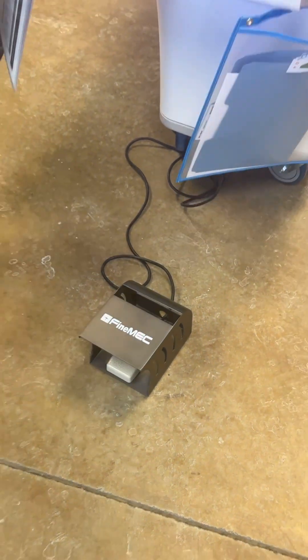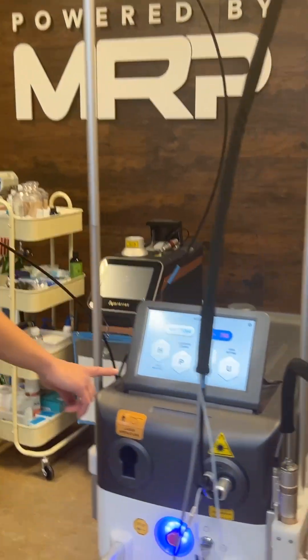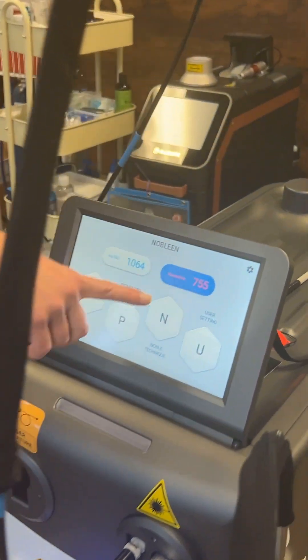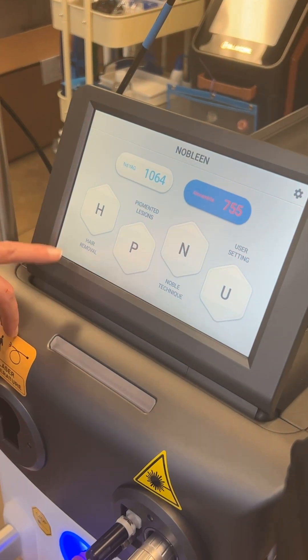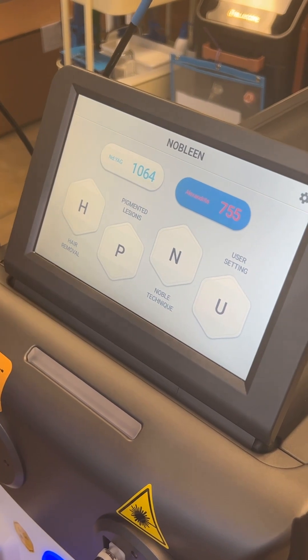Your foot pedal is actually in the front of the device and not the back, so your device will not be tripping over its own cord. This is what the interface looks like. You have your 1064 and 755, hair removal, pigment lesions, and you have a technique option. We're going to go into that and then also use your settings.